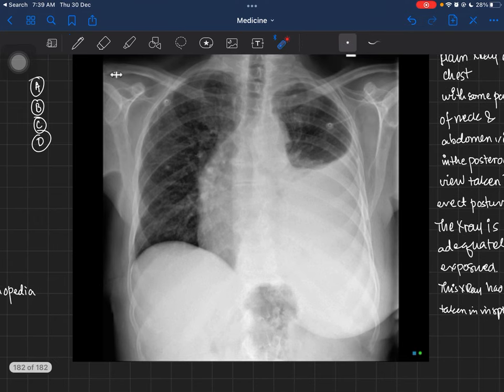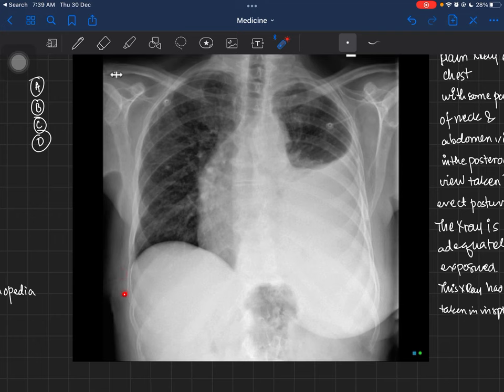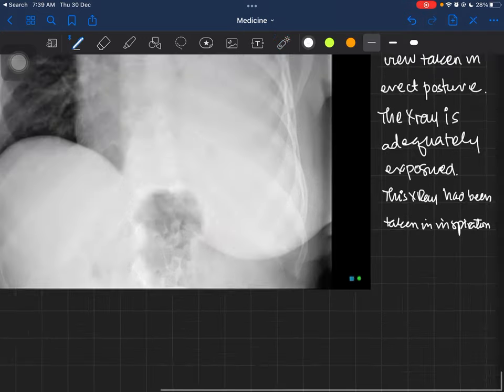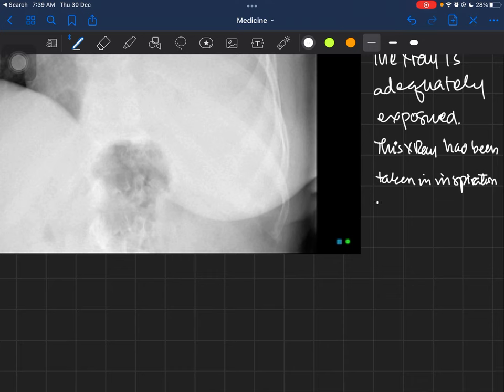Also comment on the soft tissues. Sometimes patients have a chest drain in situ and there may be surgical emphysema in the soft tissues. There could also be emphysema from a lung abscess or tumor. Don't be confused by the breast shadow visible here — it is simply the shadow of the breast of this female patient.